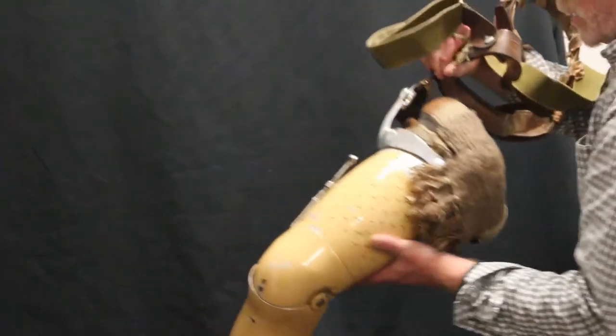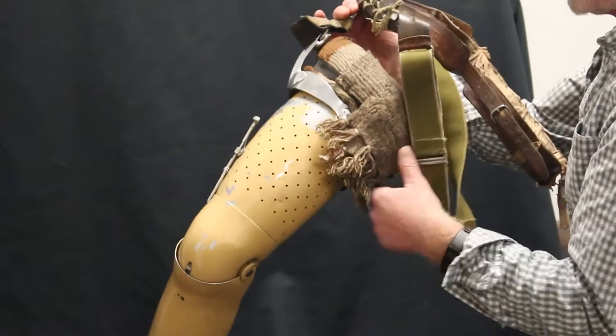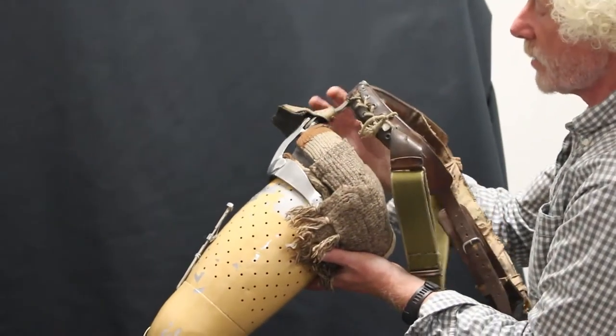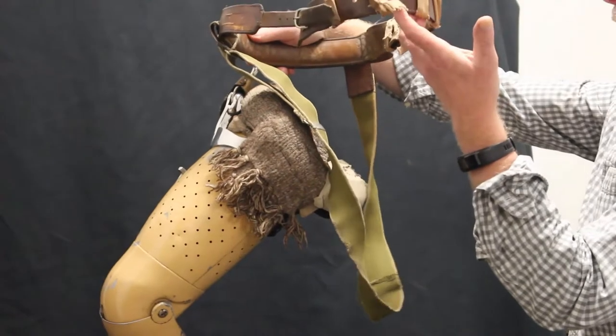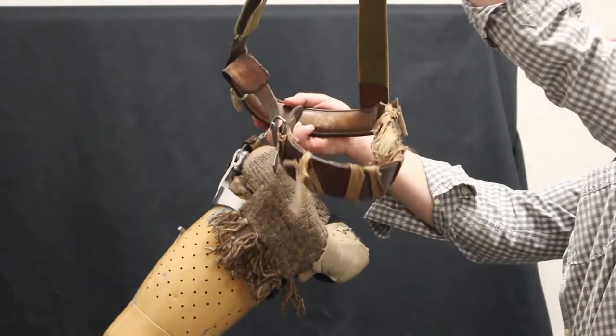The limb would be secured to the body with this movable bracket on the side of steel leading up to leather strapping and a form of brace to come up and take the weight over the body.